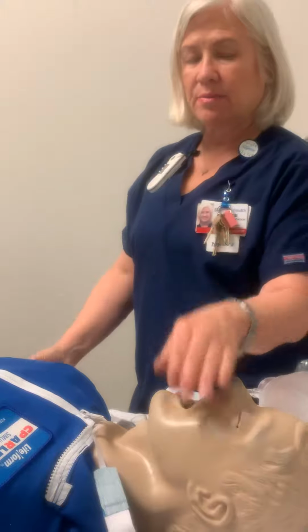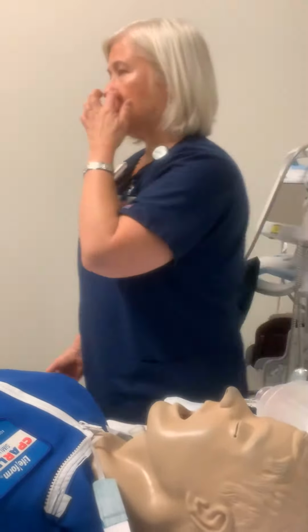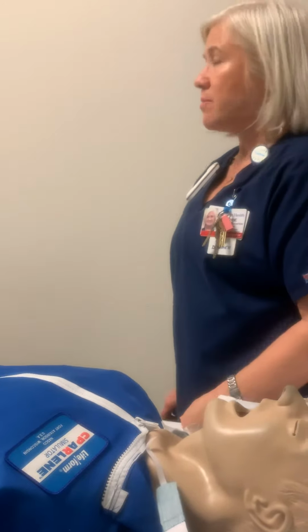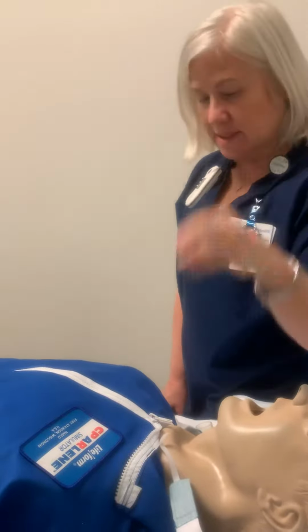Yeah, so in that event, although you can do both, it wouldn't be optimal to go up here. You just wanna go down to his stoma. Yes. It really appears that he's mouth breathing. Even though he is trached, and I understand why they trached him, he appears to be mouth breathing when you watch him. Yeah, probably. It's just a natural reflex that people wanna do that. But for him, you'd wanna ventilate down here, which is perfectly okay. Because remember, with a trach, you can do here or here. With a partial laryngectomy, you can do here or here. But with a laryngectomy, it's gotta be here.